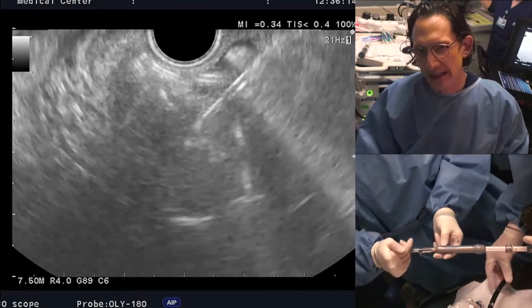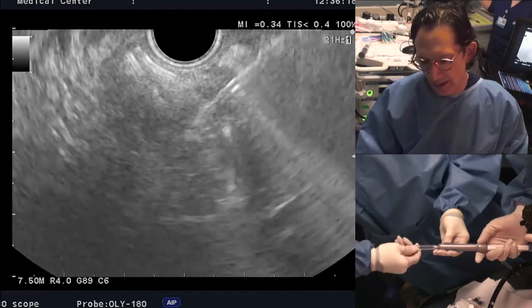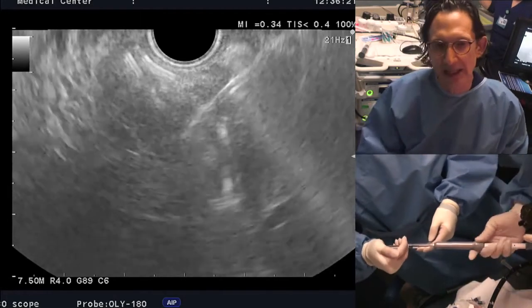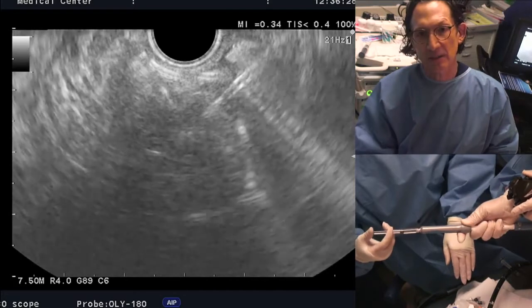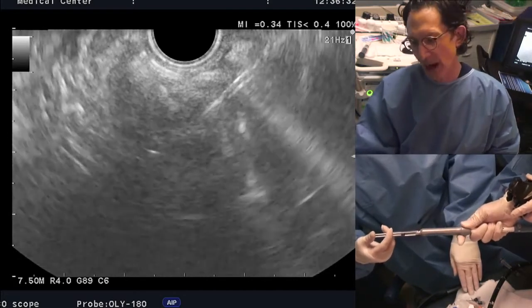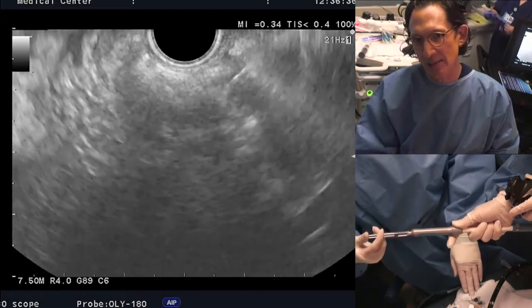All right, so we've got our injection in. We're flushing the needle, so we're flushing out the glue from the dead space. And I'm going to retract as soon as all of the dead space is out, which is about a cc, right, in the dead space, correct? So after we've had a cc, I can start retracting. You see me retracting? The needle comes back.